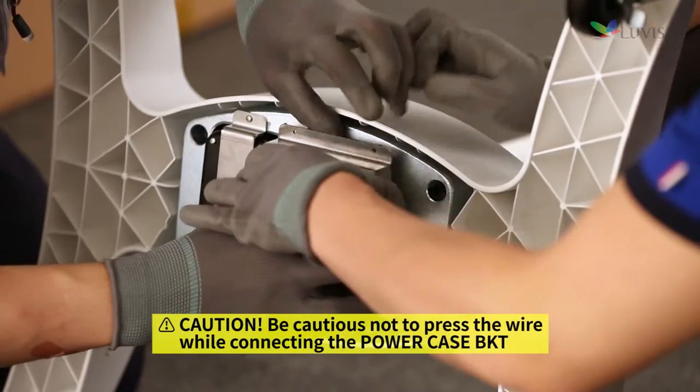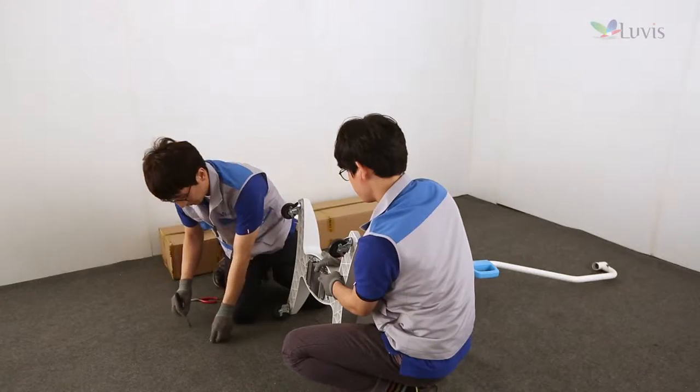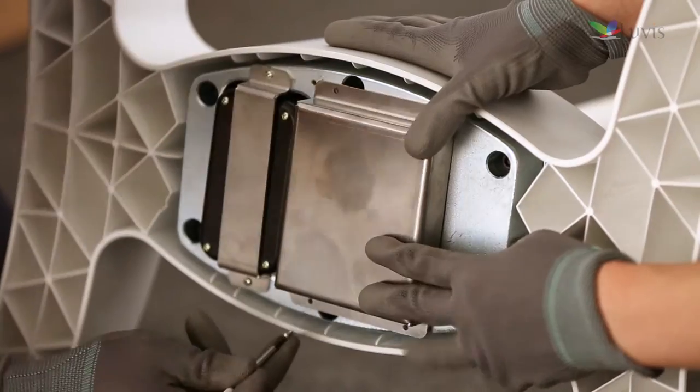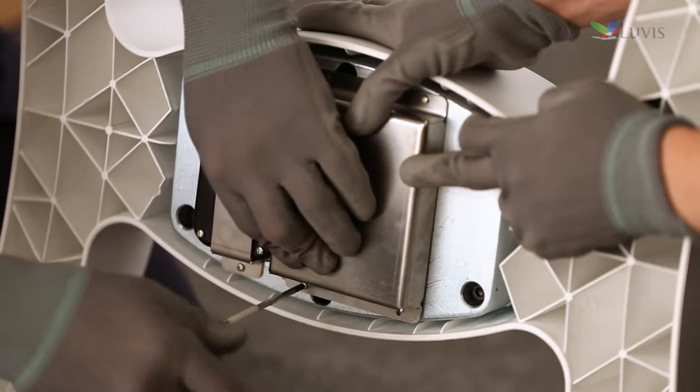Tighten the power case bracket as shown on the screen. Tighten four screws to fix the power case bracket using a plus-head driver, regardless of sequence.